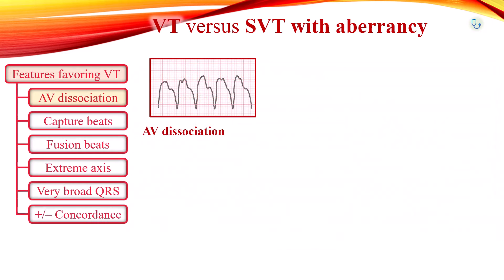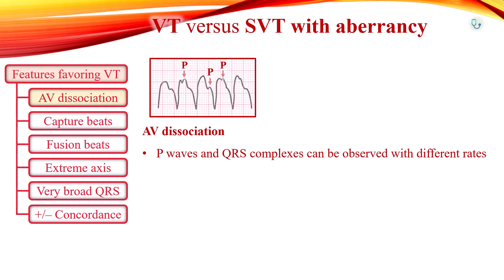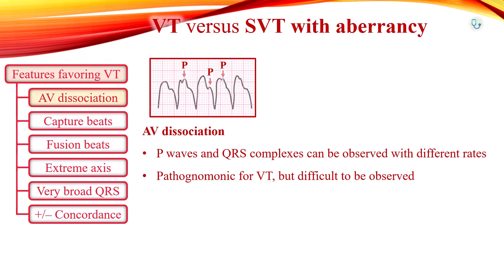In AV dissociation, P waves and QRS complexes may be observed with different rates. AV dissociation is pathognomonic for ventricular tachycardia, but P waves are often superimposed on QRS complexes and may be difficult to observe. Capture beats and fusion beats are also evidence of AV dissociation and indicate VT.